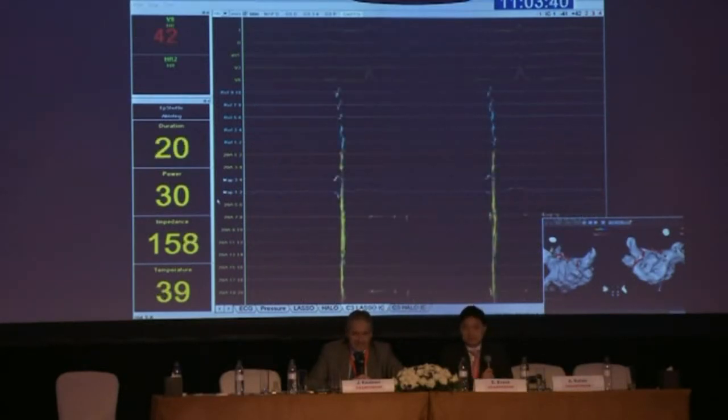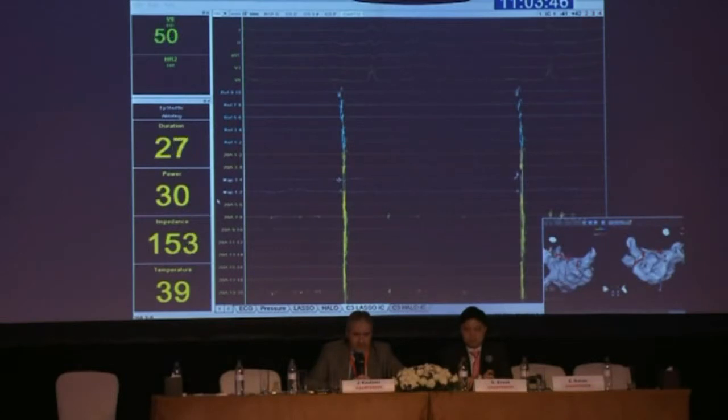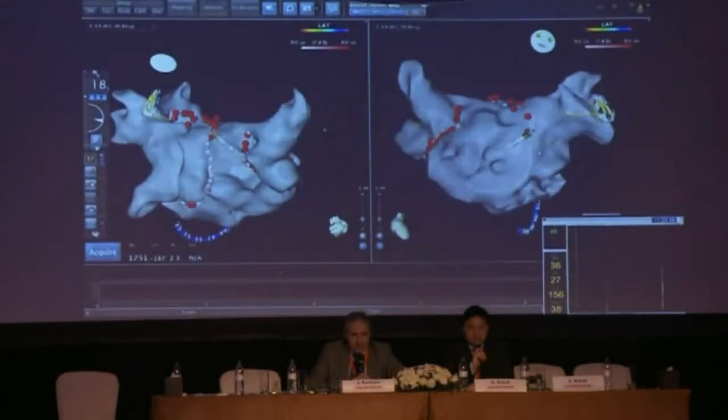Very interesting. It was the activation that drove me to that site, and it's a bit cheaper than Topera. Can we see the map now, to be able to localize exactly the spot? Bigger map, please. So we need your glasses, Richard, to be able to see these rotors instead of having expensive mapping systems. Very impressive.